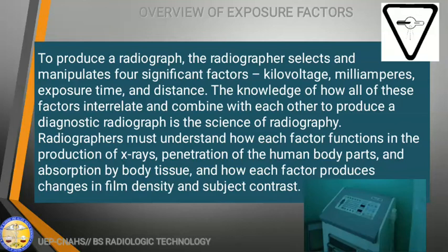Most of these technical factors will be found in your operating console. There you have the kVp, the mA and exposure time. They are combined as a single exposure, mAs. The distance is, of course, something you as RadTechs will identify, from a certain point. That is the placement of your X-ray tube for a specific distance. I hope you can get me.